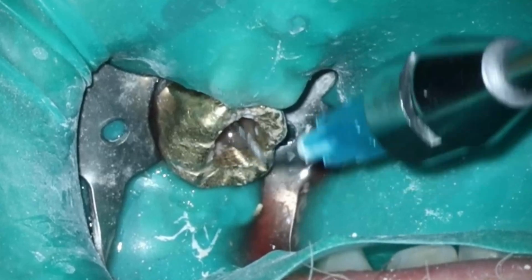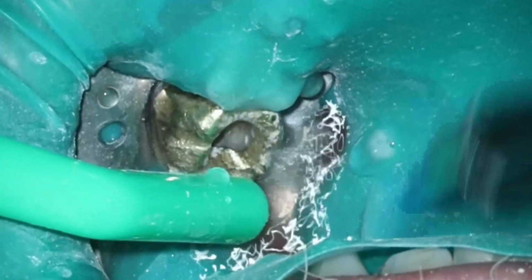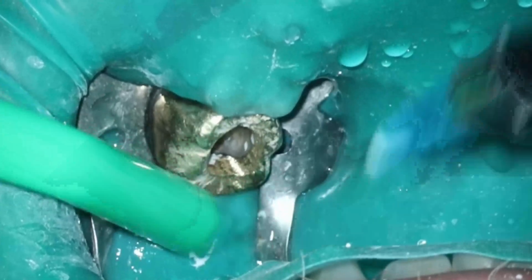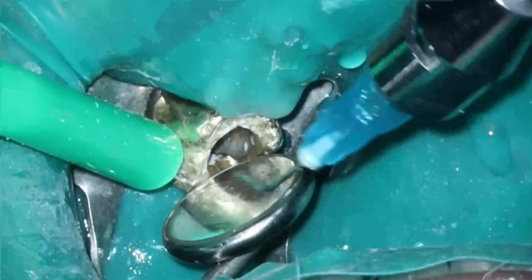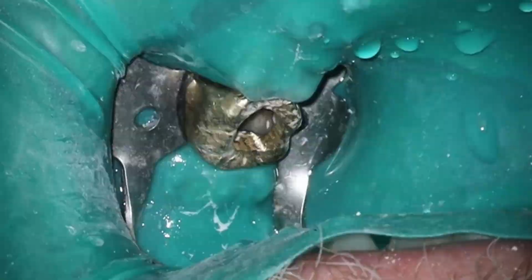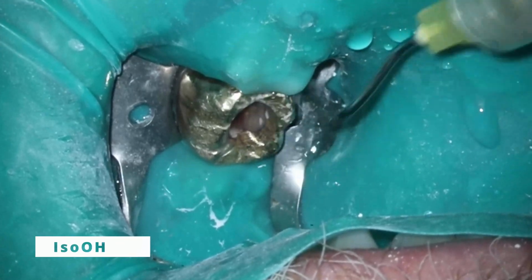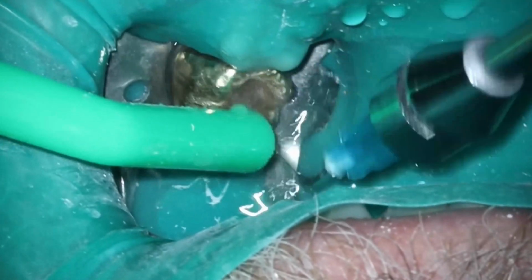He does travel from almost 4 hours away. So we kind of had to just hold on as best as possible, do some intrapulpals and get him numb, because I don't think there was any amount of anesthetic I could give that would get him completely numb. The good news is once you get that pulp out, it's pretty straightforward to get the rest of the tooth taken care of. We're going to use the GentleWave here just because we were in there. We had it open. It's a great seal. It's a good case for the GentleWave just to show off and get it looking as clean as possible.